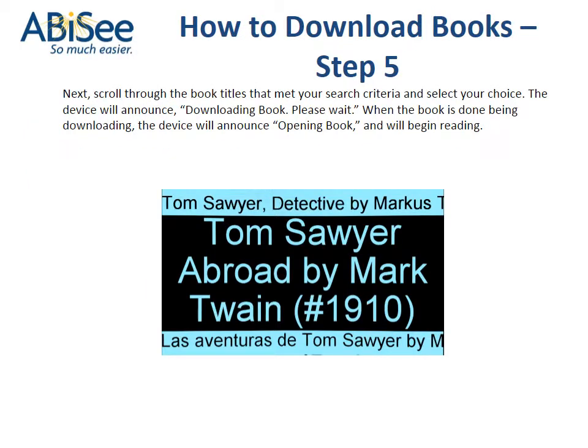How to download books. Step 5. Next, scroll through the book titles that met your search criteria and select your choice. The device will announce, "Downloading book. Please wait." When the book is done downloading, the device will announce "Opening book" and will begin reading.